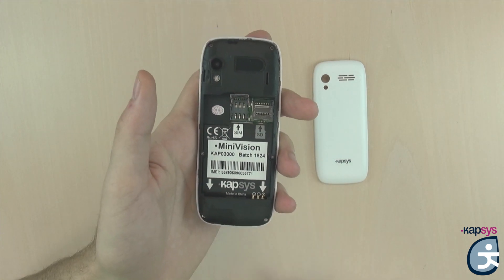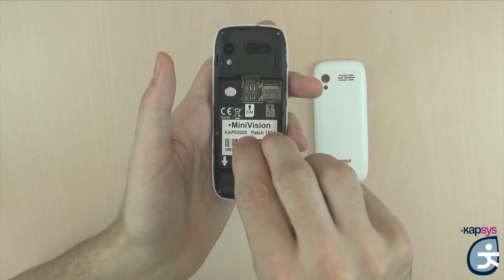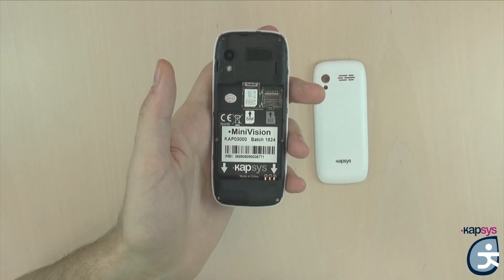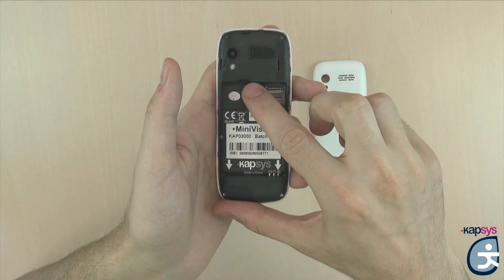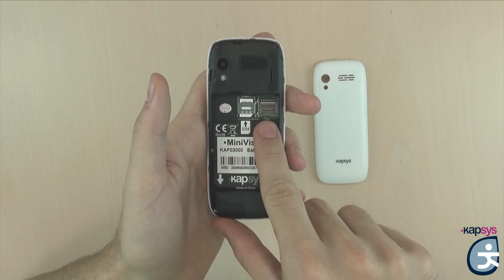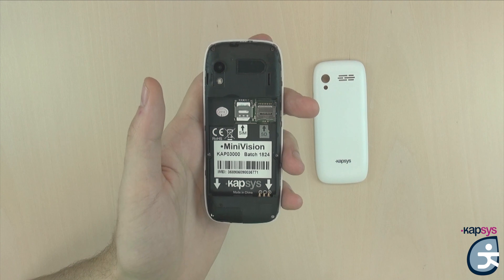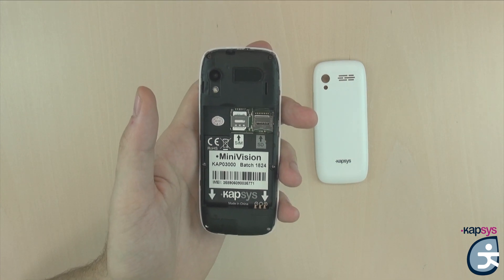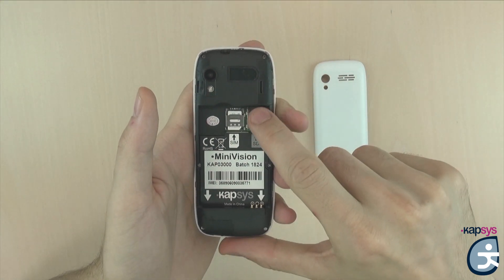Simply put the SIM card in the connector. The SIM card should be oriented with the metal contacts down and the beveled corner at the bottom right. The Minivision is compatible only with SIM cards in nano format, which is the smallest format of SIM cards. Once the SIM card is placed correctly, flip the trapdoor onto the SIM connector and lock it by sliding the door down. To the right of the SIM connector is a micro SD connector to expand the phone's memory beyond the internal 4GB already available. To insert an SD card, follow the exact same process as described for the SIM card.